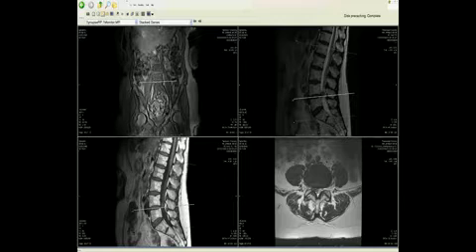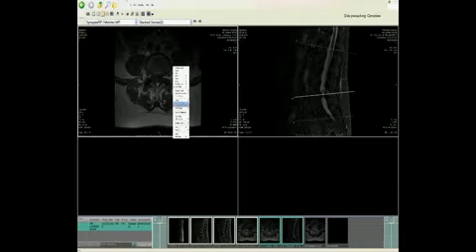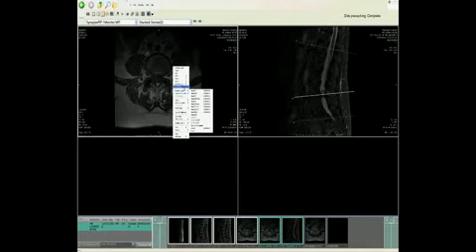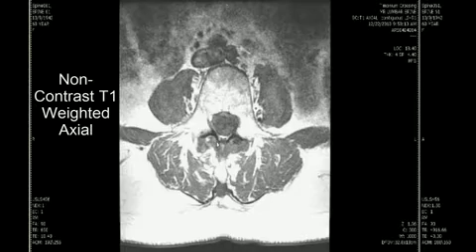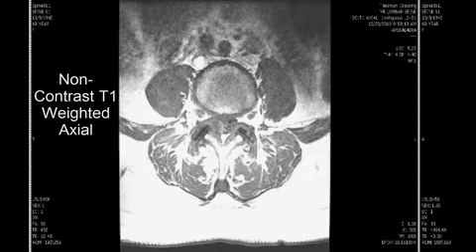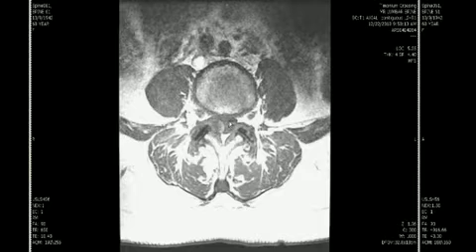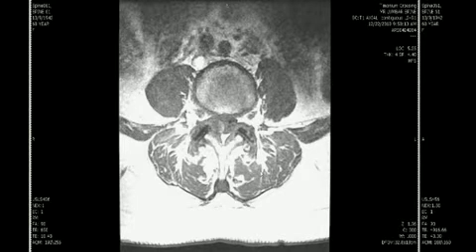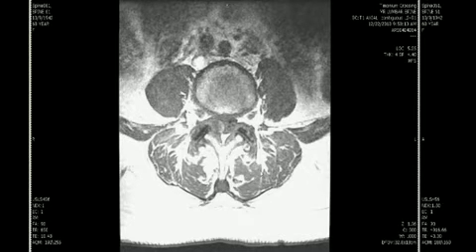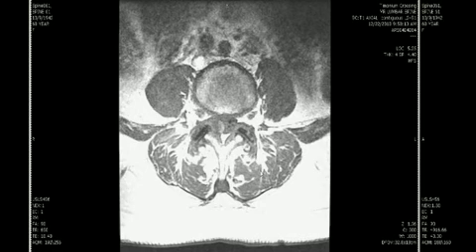Windowing this for the T1-weighted pulse sequence — a non-contrast T1-weighted scan — shows a little bit of bright signal intensity blood products again compressing the thecal sac. In summary, at the L4-5 level we have a large synovial cyst on the right side compressing the thecal sac as well as the right L5 nerve root, accounting for the patient's right-sided pain.